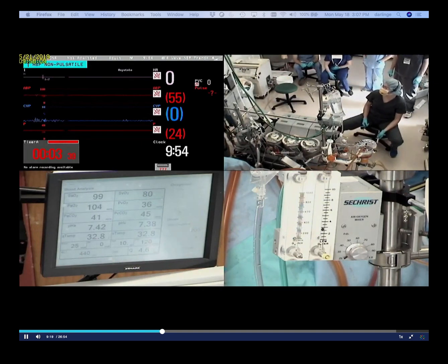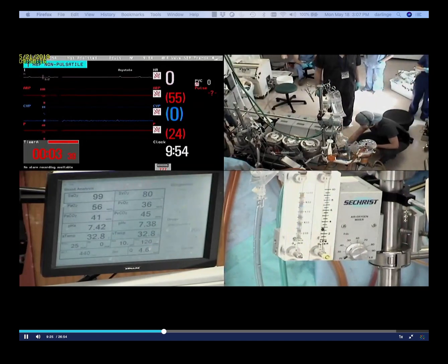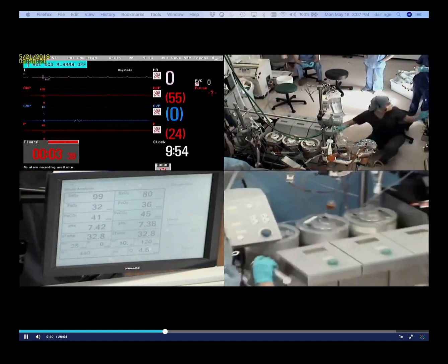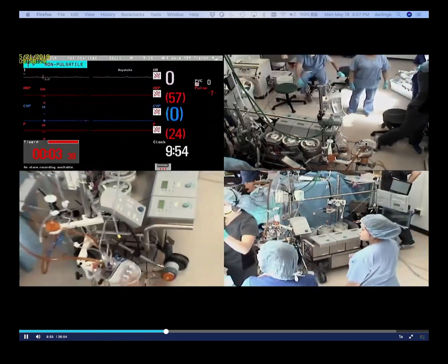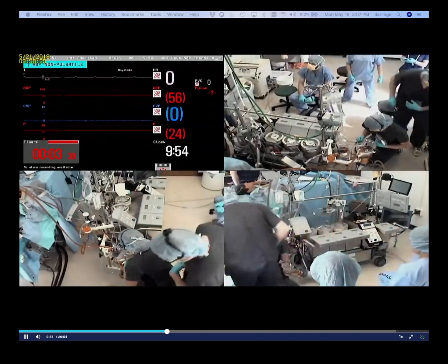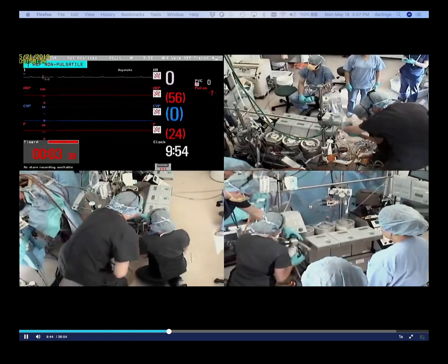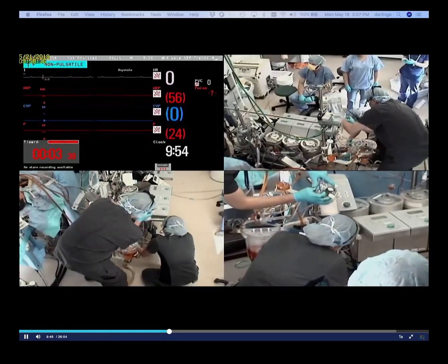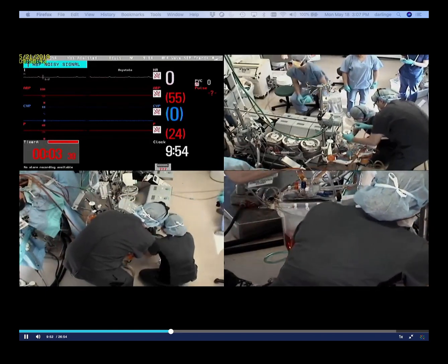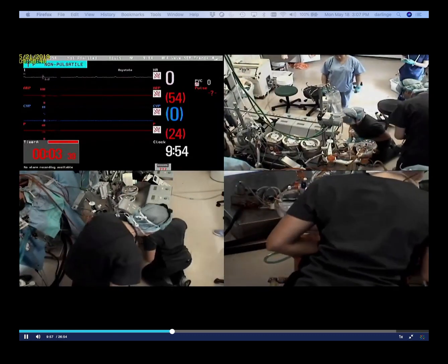Well, it's starting to fail and I'm going to cut in — I'm going to cut an arterial oxygenator in. I can keep working up there — I'm going to stay on bypass but swap the oxygenator. Can you grab the new one? Sterile scissors? We're still on pump. I have a setup back here — I don't have to go off pump to do this.